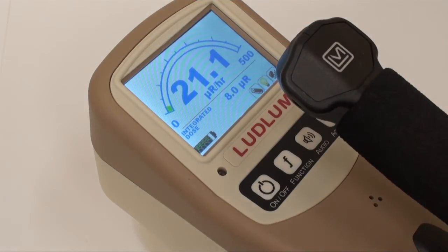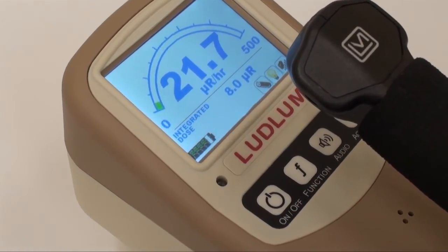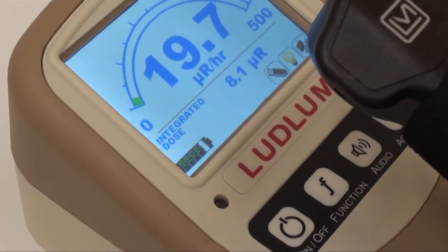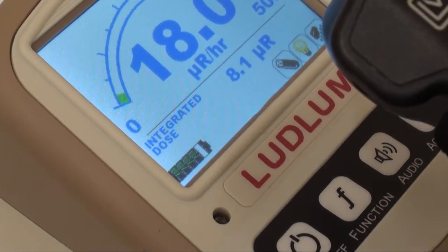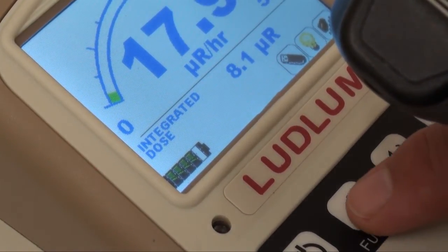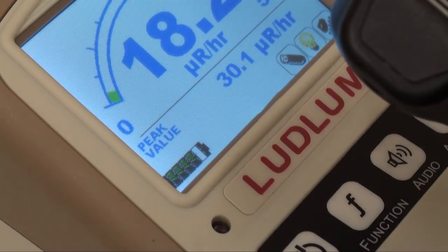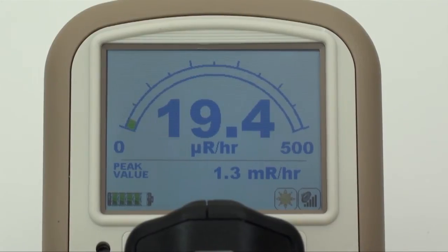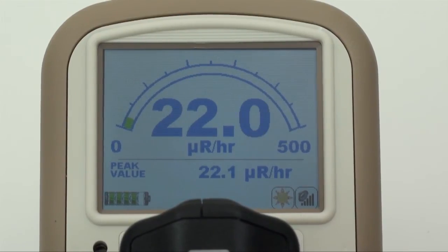In addition to the primary radiation readout, the 9DP can simultaneously display another value of the user's choosing. Pressing the function control button toggles a secondary measurement readout between the integrated dose or peak rate value. Both functions are running independent of whether or not they are being displayed and can be reset to zero any time the instrument is powered on or by manually pressing the reset button.